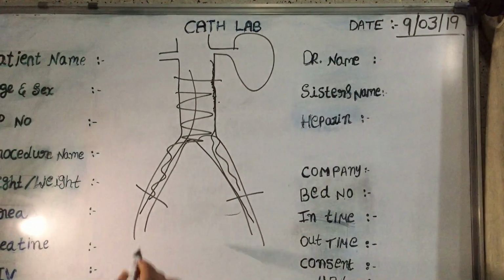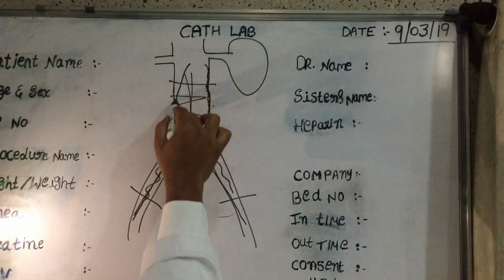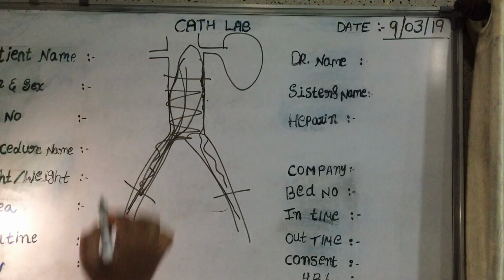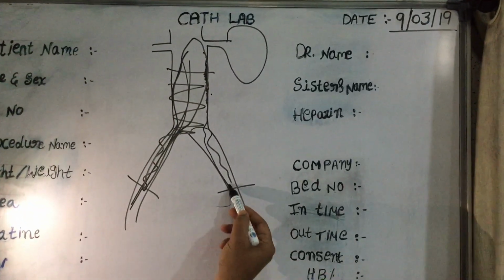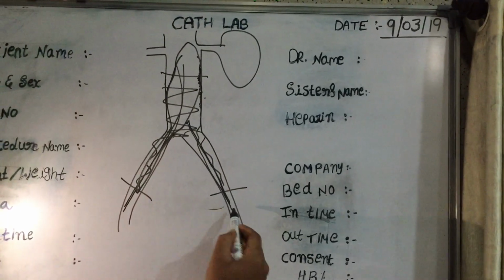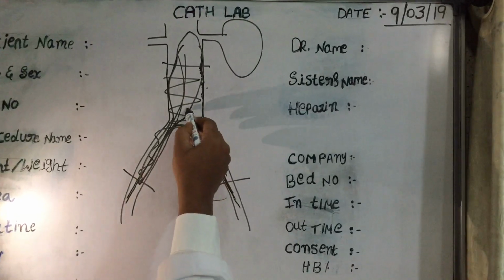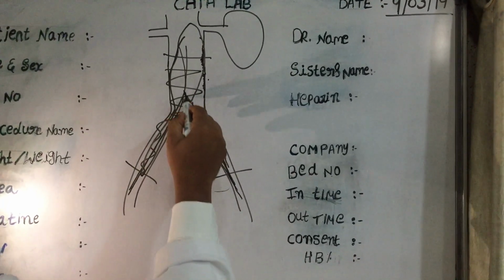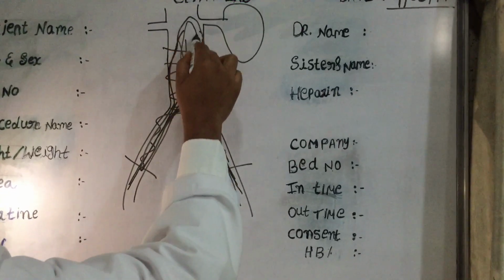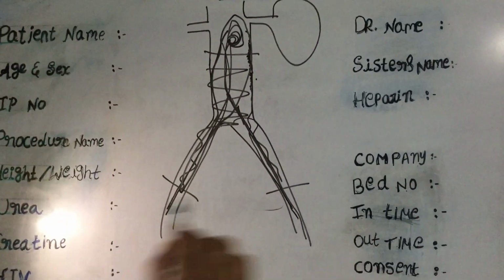So what we try to do is, once you have crossed from one side into the aorta, we put a balloon like this. We put a balloon here, and then we go with a long sheath, and then we put a beveled needle through the catheter over here, and then we take a Chiba and try to puncture the balloon. Once we have punctured the balloon, we put a 14 wire which goes inside and makes a coil over here, and this is the wire.